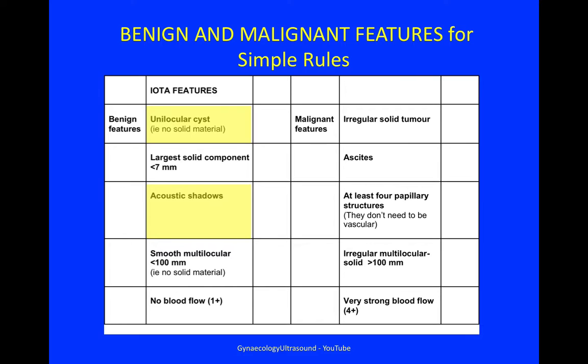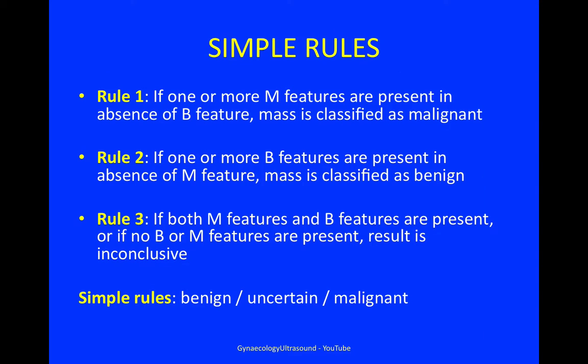It is a unilocular cyst — that means there is no solid material — and acoustic shadowing. In the absence of any malignant features, this looks to be benign. As the simple rules state, if one or more malignant features are present in the absence of a benign feature, the mass is classified as malignant. If one or more benign features are present in the absence of a malignant feature, the mass is classified as benign.